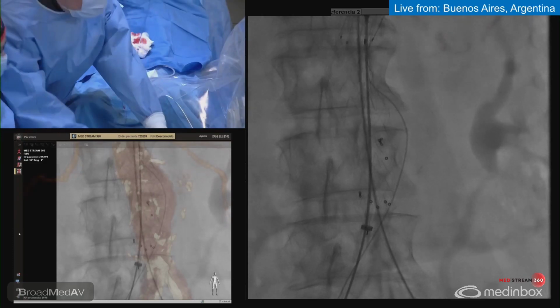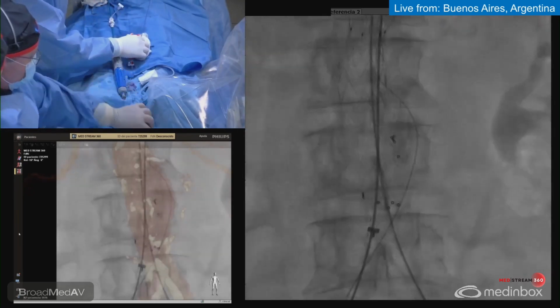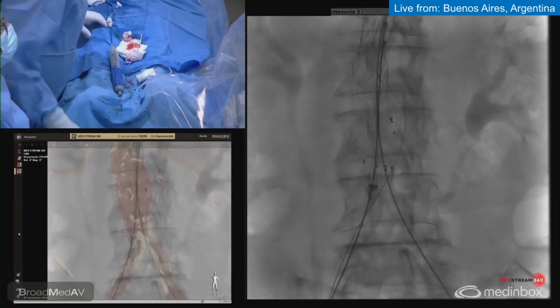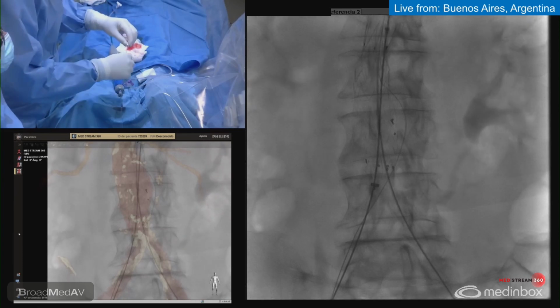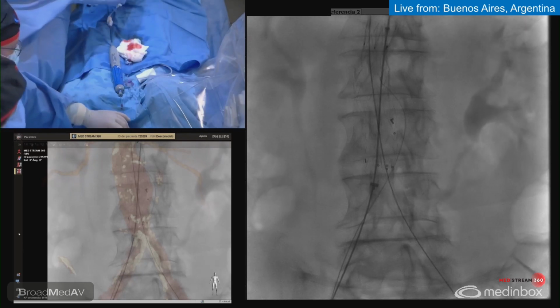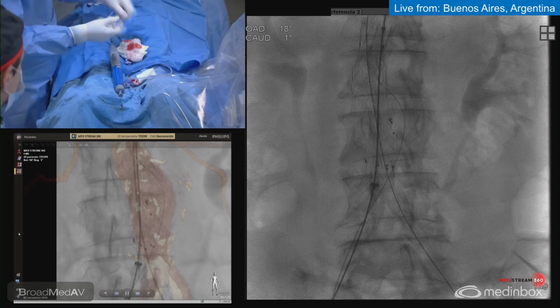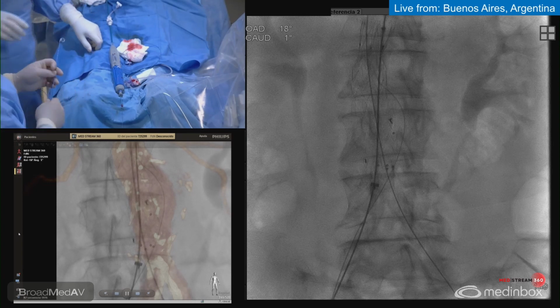Okay, excellent question. Which are the potential complications? First, vascular access is always a potential complication because a big sheath can always complicate. Okay, and this is number one. We can have bleeding. We might need a covered stent. We need surgical repair, retroperitoneal bleeding, and any other occlusion, late stenosis that we have in some cases. This is a potential complication. Are you going to size?